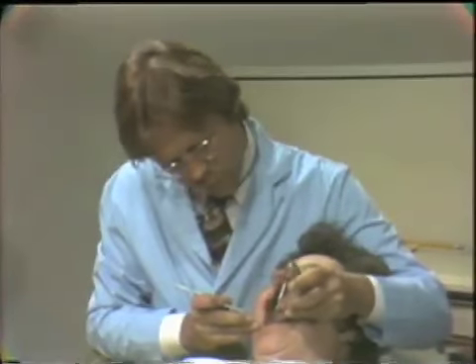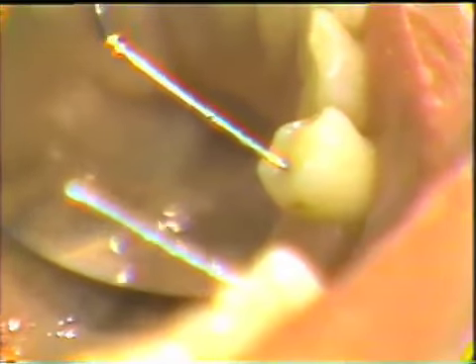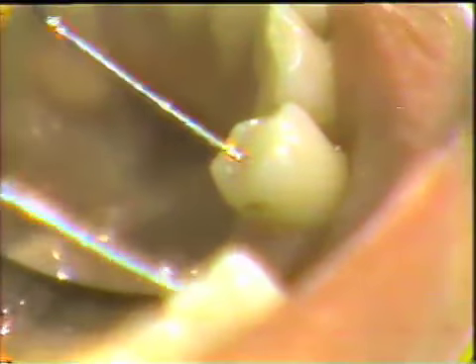This is also true in the bicuspid area. We want to look at that tooth to see if there is enough room for the minor connector. Now, it is very important also that the occlusal rest be deep enough into the tooth.